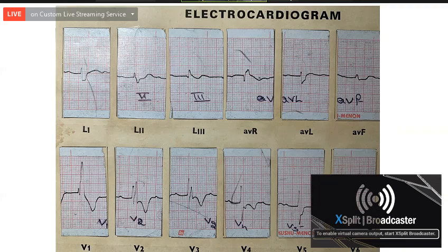So, out of these conditions that you described, what is the cause of the broadening of the QRS complex in this patient? Bundle branch block. Which one? Right bundle, left bundle? Right bundle branch block. So this patient has right bundle branch block and first degree heart block. And what is the QRS axis?